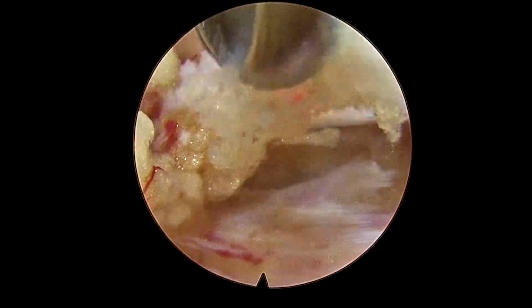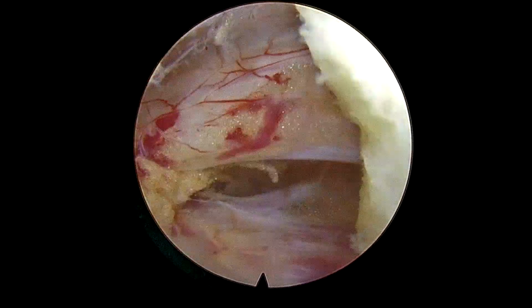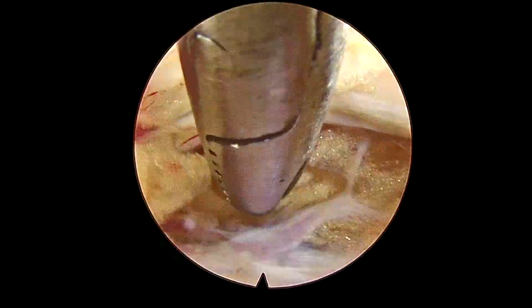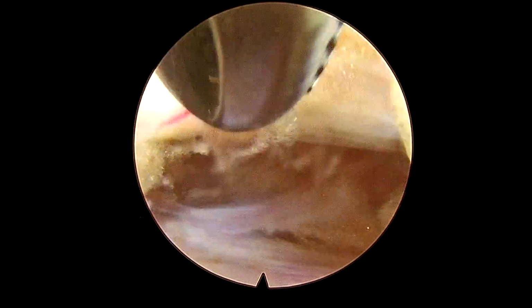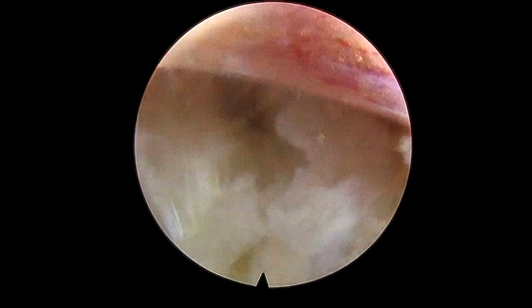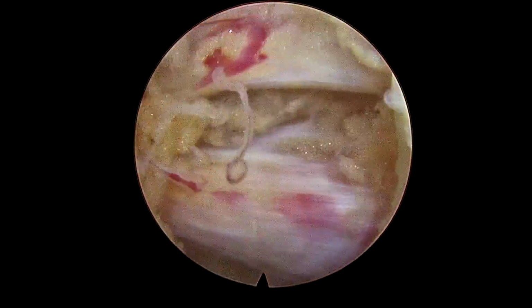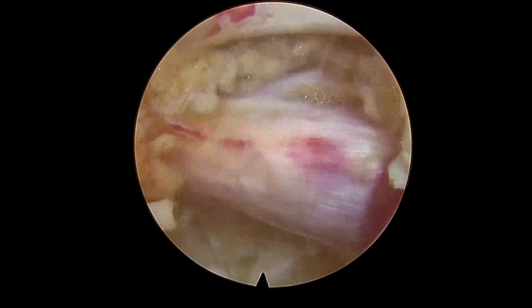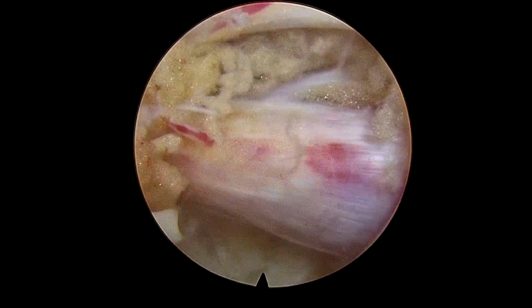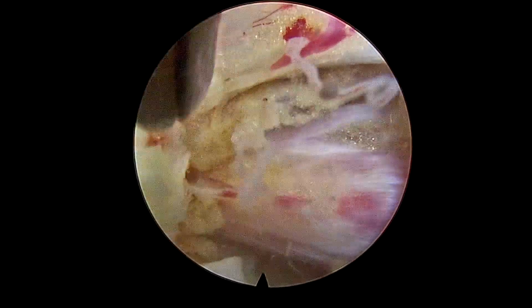Now we have completed our discectomy work here. This is nothing but the final decompression. You can see this is the traversing nerve root and the dura. We can retract this traversing nerve root very easily without any tension. This is nothing but the axilla.